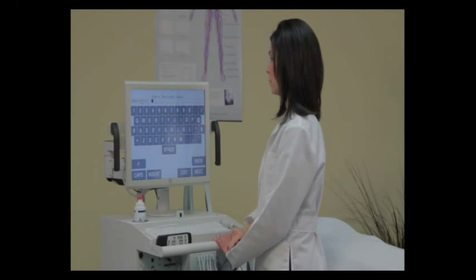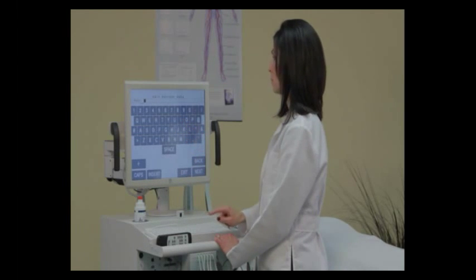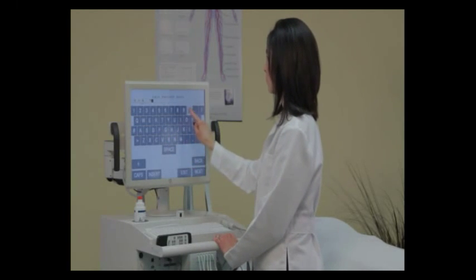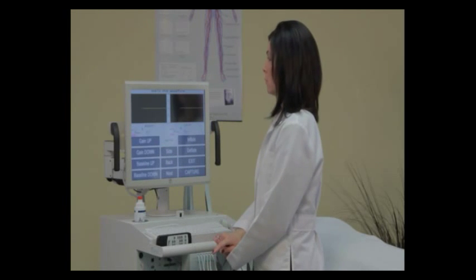Next, you'll be prompted to enter the operator name or initials, sex of the patient, and date of birth. As you see on the screen here, we are going to be prompted to do an ankle PVR waveform.